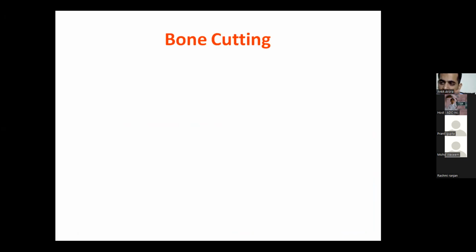Okay, so let us come to the second half of our surgical procedure. We have given the local anesthesia. We have waited for 10 minutes. After that, we have given the incision in the form of the anterior incision, the intermediate incision, and the distobuccal terminal incision.